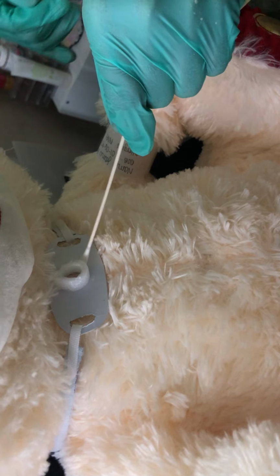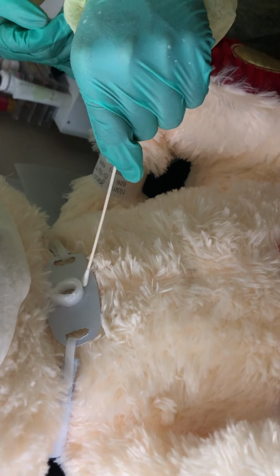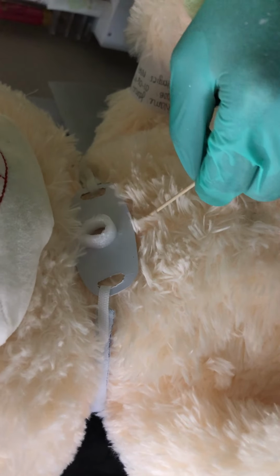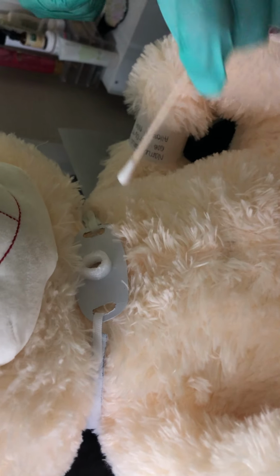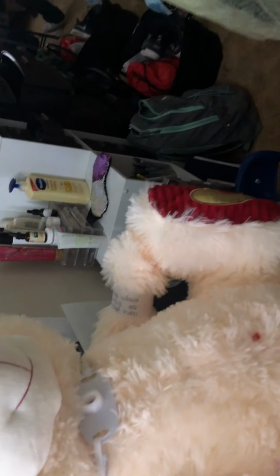I'm also going to be assessing the tracheostomy. Make sure there's no infection, there's no skin breakdown. Last one. I'm going to go underneath. Make sure I don't poke or go inside the tracheostomy because you don't want that. And it is all clean. Drop it to the biohazard.